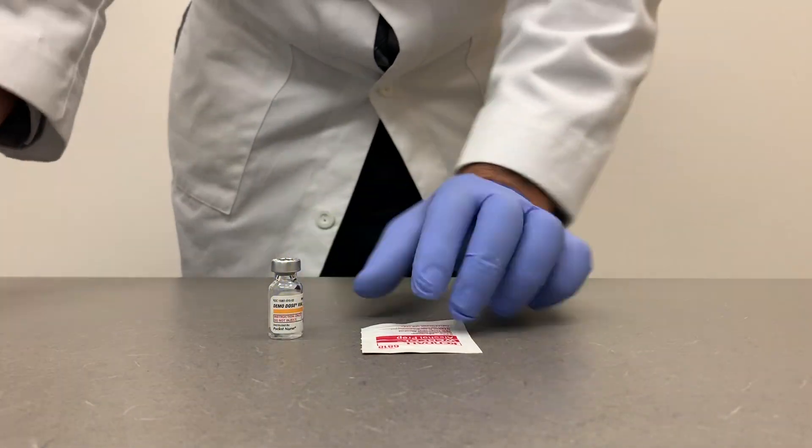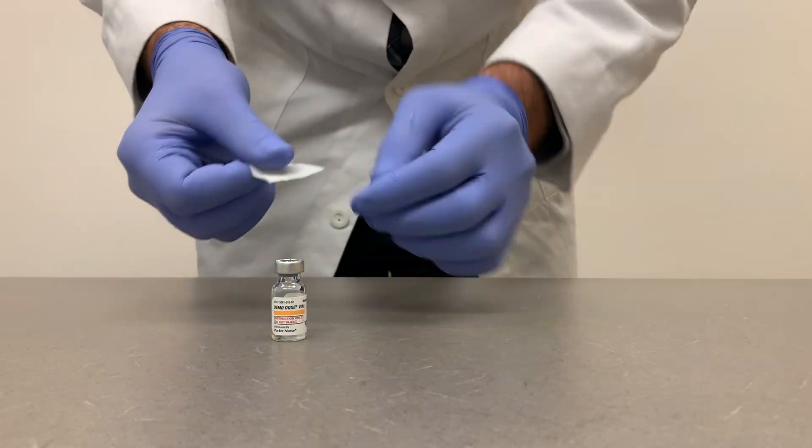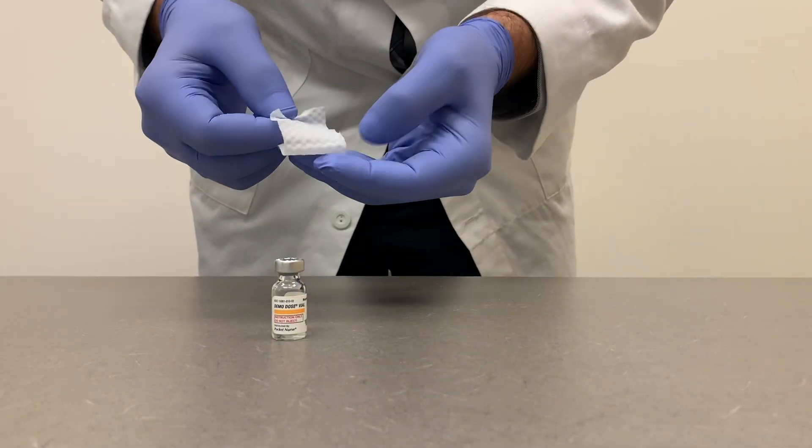The next step is to disinfect the septum stopper, and we're going to do that with our isopropyl alcohol prep swab. Avoid swiping in a circular or back-and-forth motion, as this will likely not adequately remove foreign material from the surface.